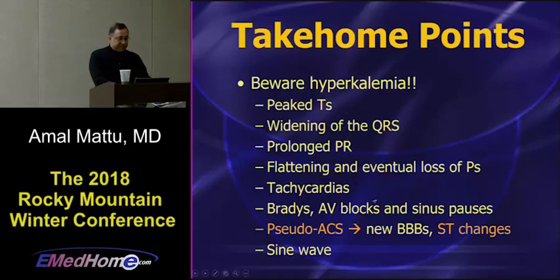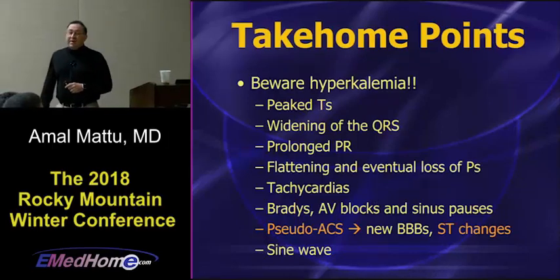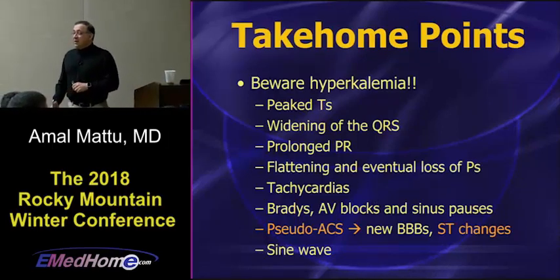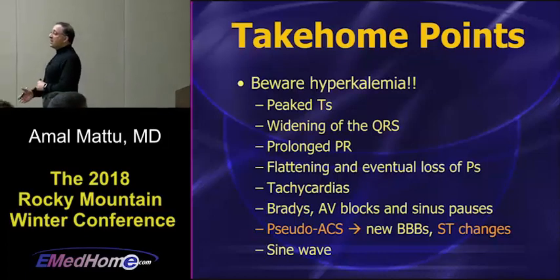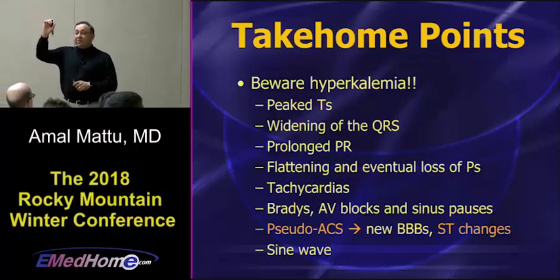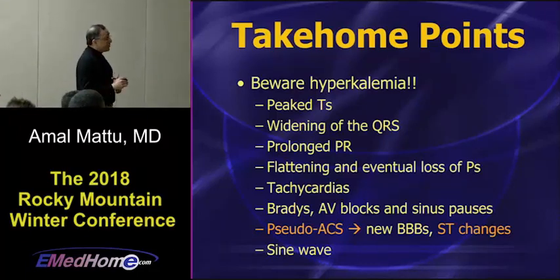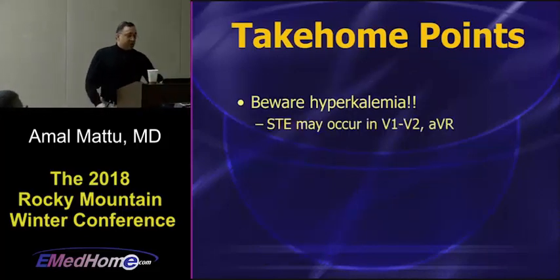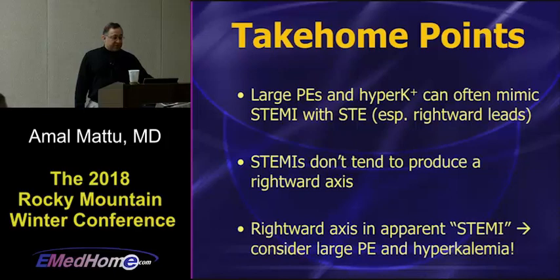Think about hyperkalemia. Again, it can give you tachycardia, bradycardia, strange AV blocks, and something that I think most of us never learned in med school or residency, it can produce pseudo-ACS. It can give you T-wave inversions and, more commonly, ST segment elevation, typically in the rightwardish leads, and oftentimes ST segment depression as well. All right. So take-home points: beware hyperkalemia again in those rightish leads, V1, maybe V2, and aVR in particular.